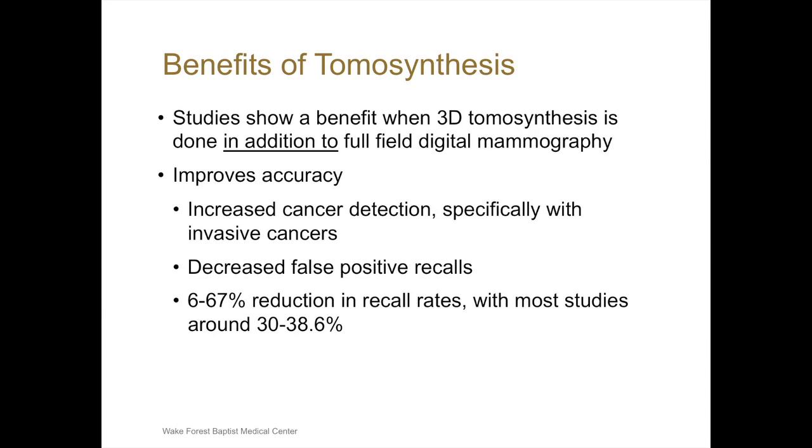So what are some of the benefits? Well, the benefits of 3D tomosynthesis have been shown when it's used in addition to the normal 2D mammography. Tomosynthesis improves accuracy, so it's helpful in increased cancer detection. Some studies have shown 15 to 20% increased cancer detection, specifically invasive cancers.